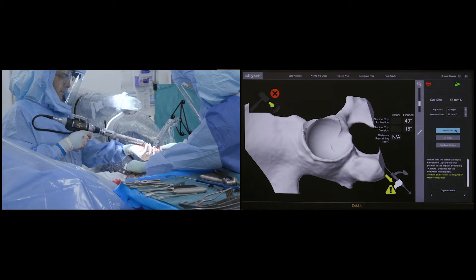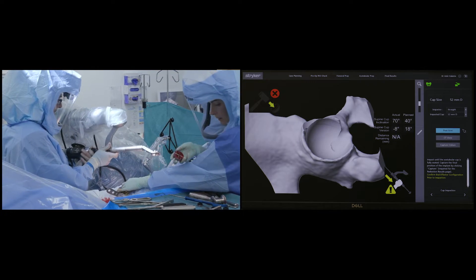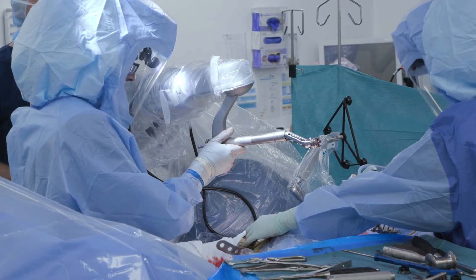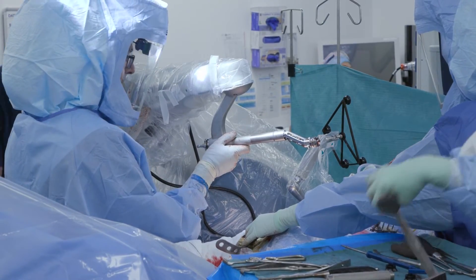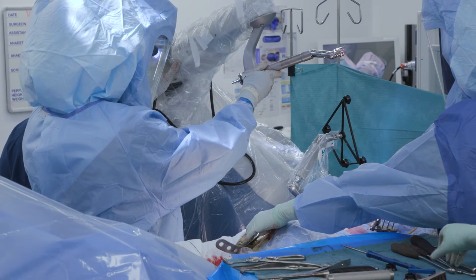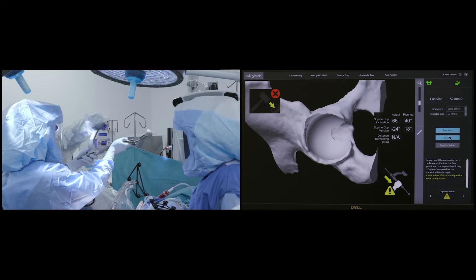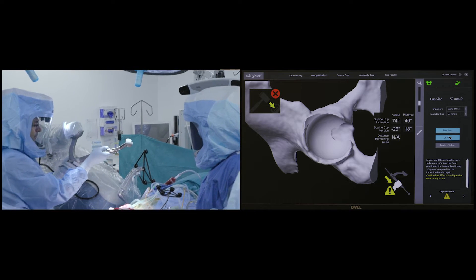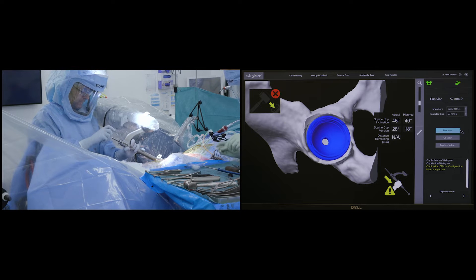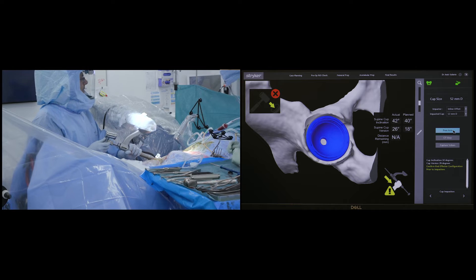Traditionally at this stage one would use intraoperative x-rays to determine the position and orientation of the cup. However, with the robot we have been able to remove this extra step, reducing radiation exposure to both staff and patient. Once reaming is completed, the reaming handle is removed and the cup introducer with the cup is loaded onto the robotic arm and gently introduced into the acetabulum.